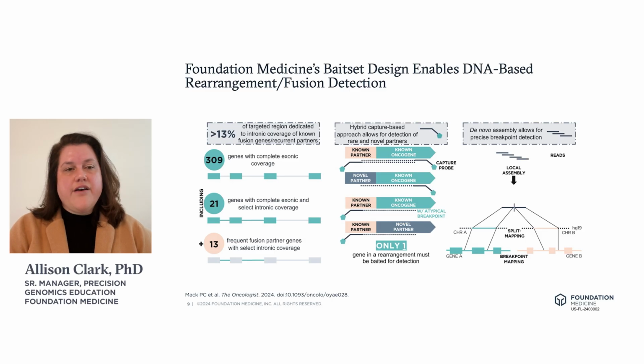And the last thing is that we do use a de novo assembly approach, which allows for precise breakpoint detection. Here, we're not mapping the reads to the human genome, which means that those reads that are not easily mapped to the human genome representing fusions are not discarded and can be detected.